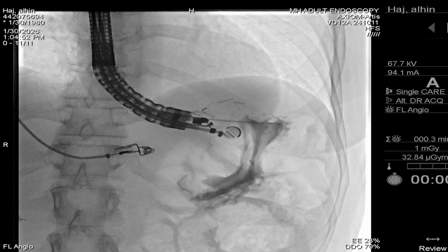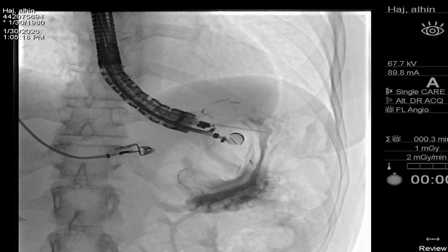If you need to go to another room, you can switch. Otherwise, you can stay with us. Now I'm injecting methylene blue with saline, only a minimal amount of contrast initially, just to delineate the isolated stomach. And now we keep the EUS inflating. Can we have the EUS in the view, please?